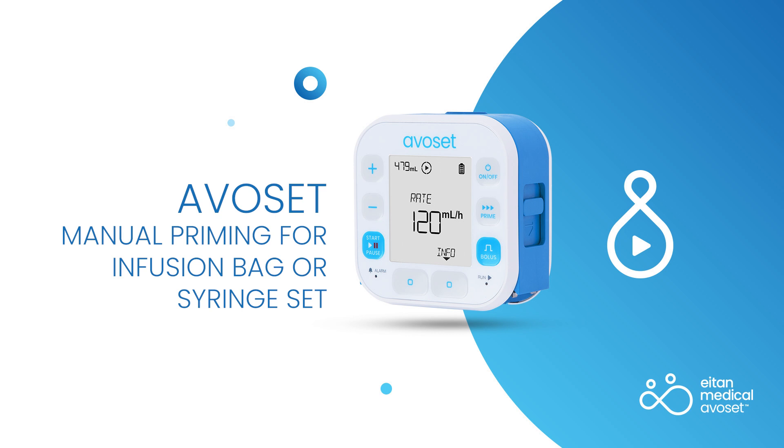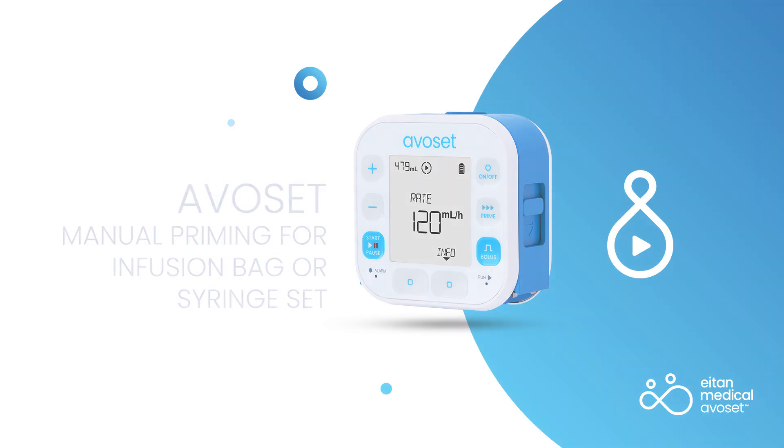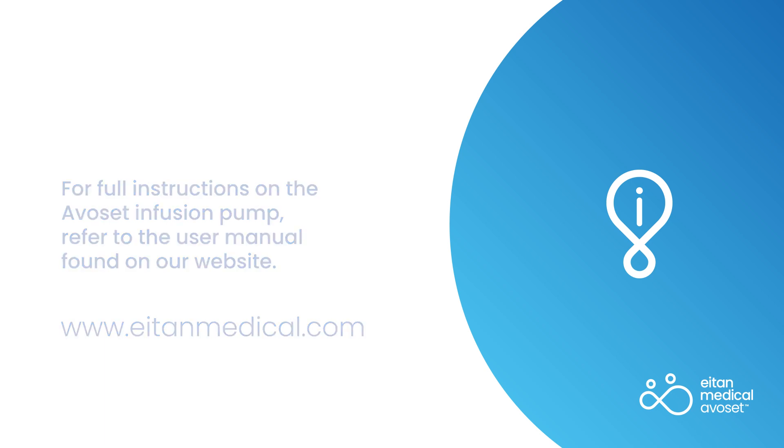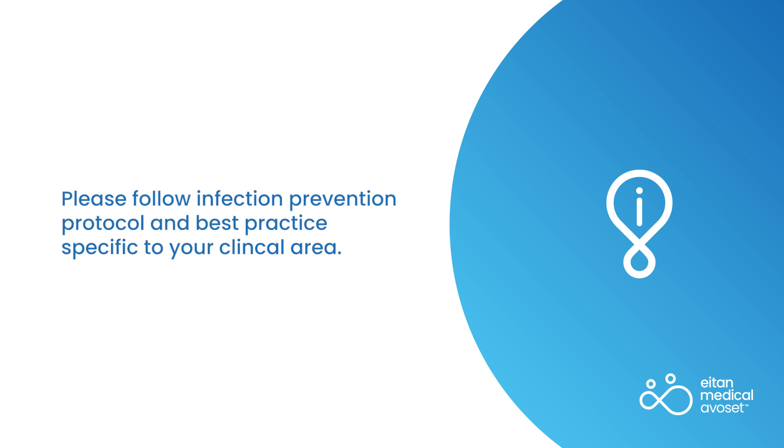Manual Priming for Infusion Bag or Syringe Set. For full instructions on the Avocet infusion pump, refer to the user manual found on our website. In this video, you will be shown how to manually prime when using an infusion bag or syringe set. Please follow infection prevention protocol and best practice specific to your clinical area.